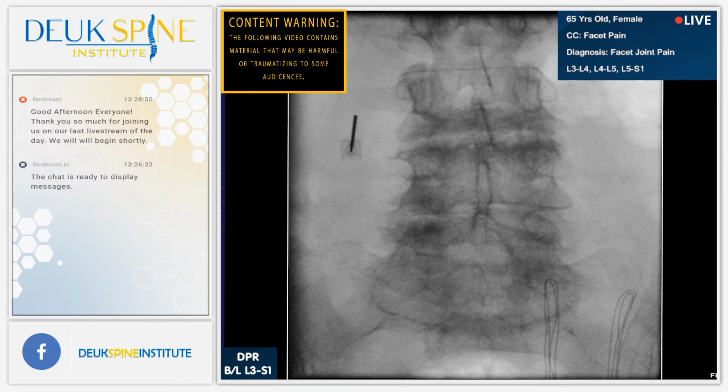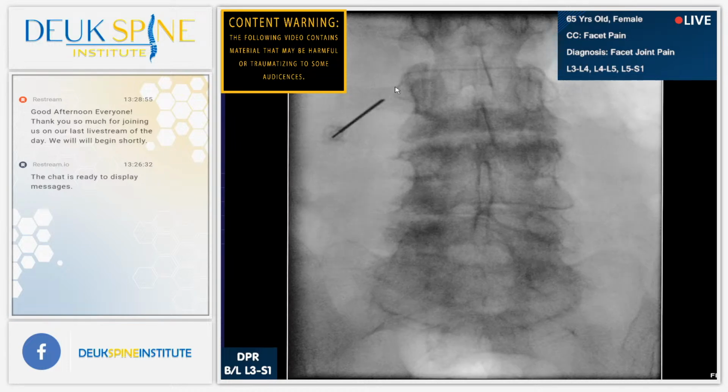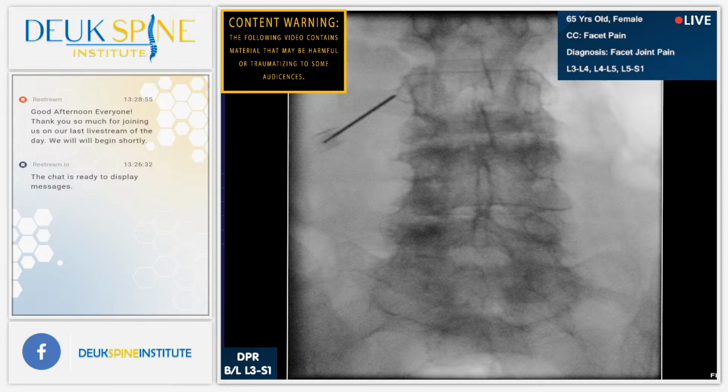So I have to target the junction of the transverse process and the pedicle of L3, right where the arrow is basically. And there we are. All right, so we're in the almost perfect position. Now it's probably perfect. Yeah, that's really good right there. So that's our first target.